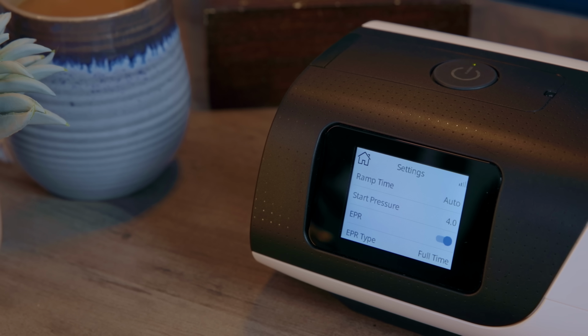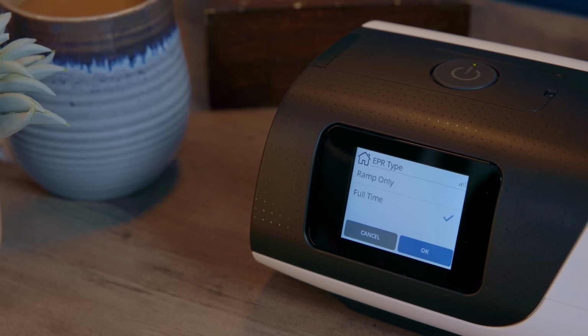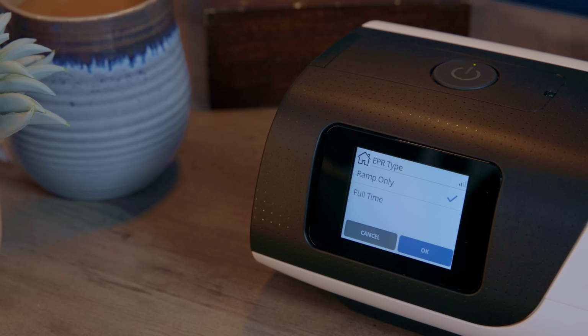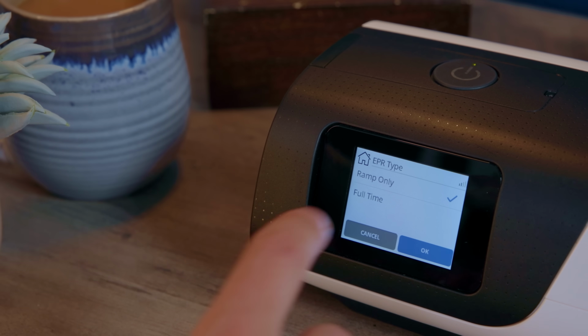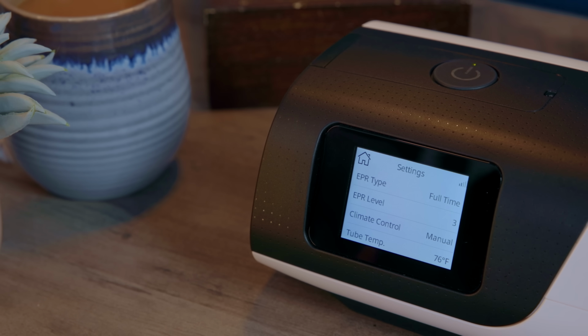If you're in the clinical menu like we are, if you set EPR to on, then there will be 2 further settings that do not appear in the patient menu. EPR type controls when the EPR is on. If you select full time, then it's going to always be on during your entire period of therapy. If you select ramp only, then it will only be on during the ramp period that you set earlier. Again, it shouldn't affect your therapy, so why not have it on full time for maximum comfort?